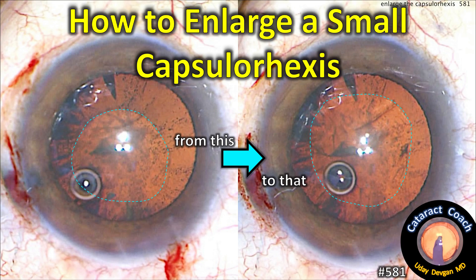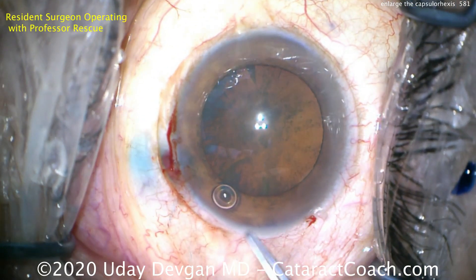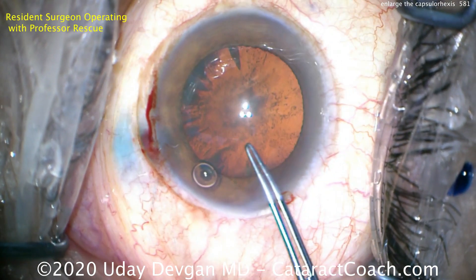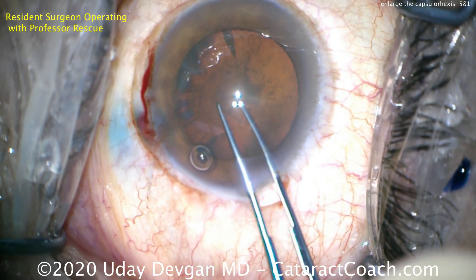CataractCoach.com — how to enlarge a small capsulorrhexis. Go from a small irregular one to a nice round and centered larger capsulorrhexis. Let me show you this case where a resident is operating.